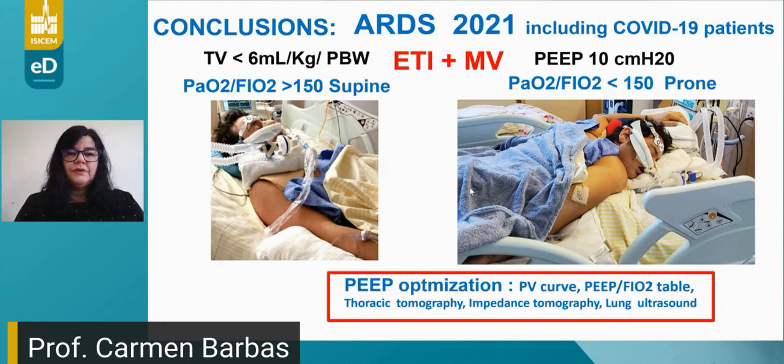And we have to do more trials analyzing the PEEP optimization with PV curves, PEEP FiO2 tables, bedside impedance tomography, lung ultrasound. And we have a lot of experience with thoracic tomography that I'm sure we can improve the knowledge of what is occurring with these severe patients, and you can plan a more protective mechanical ventilation.